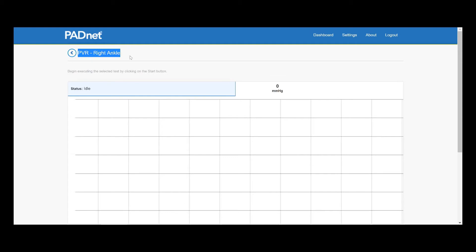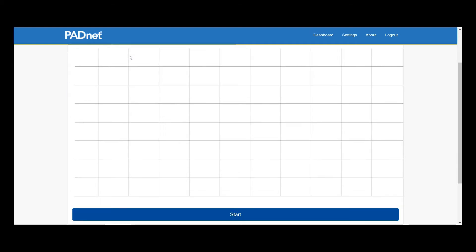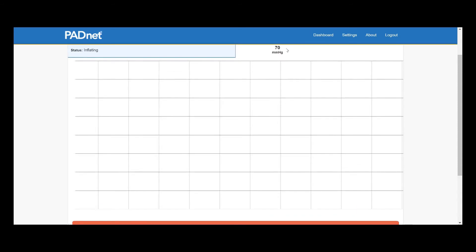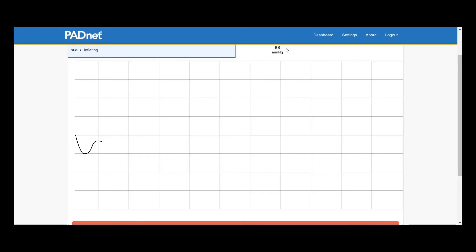We're going to start with the PVR on the right ankle. And to do our PVR, we're going to scroll down and click the start button. Our cuff is going to inflate to a pressure roughly between 65 and 75 millimeters of mercury. This is a pressure where it can comfortably sense and precisely sense the volume of blood entering the vessels without constricting blood flow. Once our cuff is done inflating, it's going to begin capturing the volume.